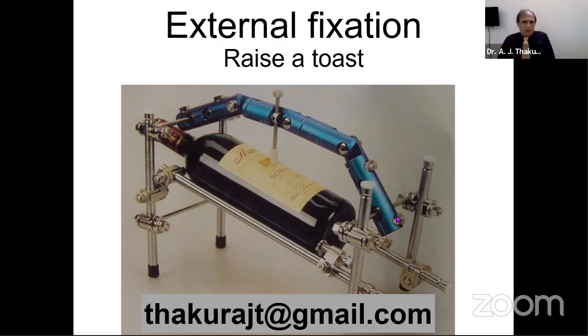No, you should not do that. That is a sure way of causing trouble. If you are applying it only as a temporary fixation, external fixation is fine, but don't apply an interfragmentary screw. That is detrimental to final healing. One should not do that.